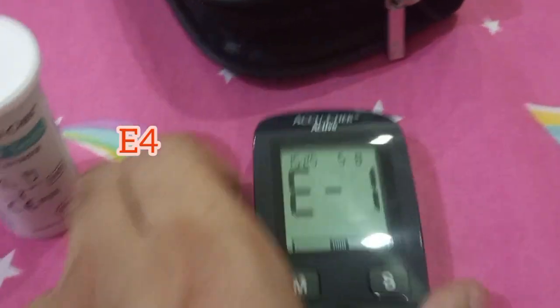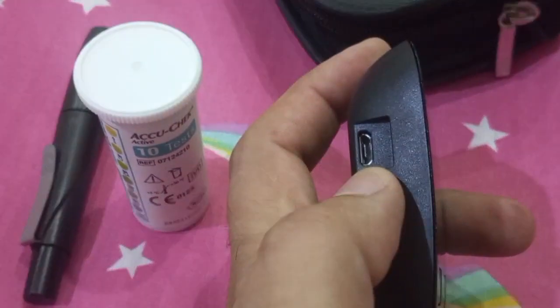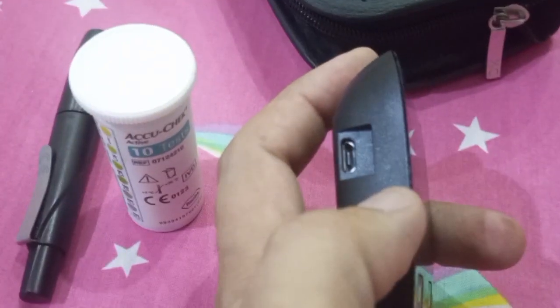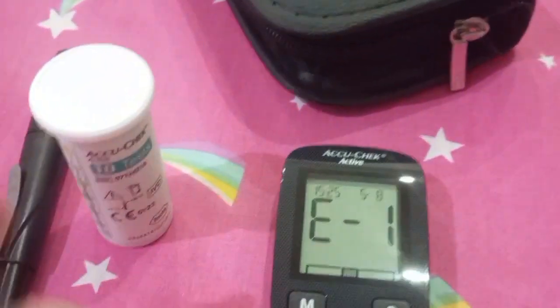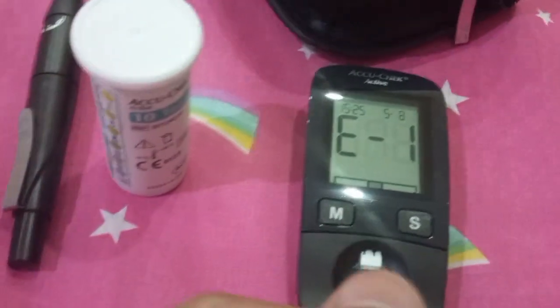If there is error E4, it simply means that you were using it with the USB connector and somehow an error occurred. Simply remove the USB connector or plug it in again and repeat the test.